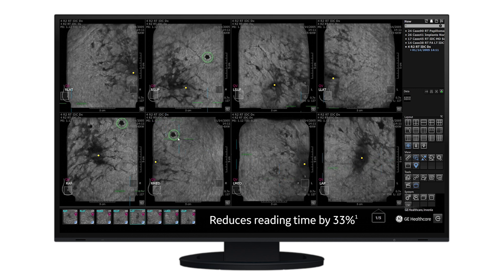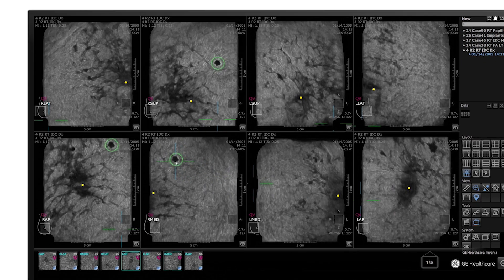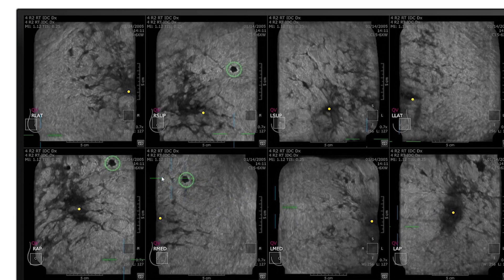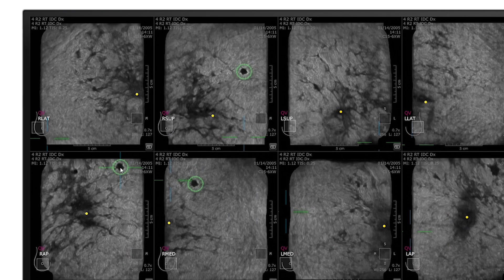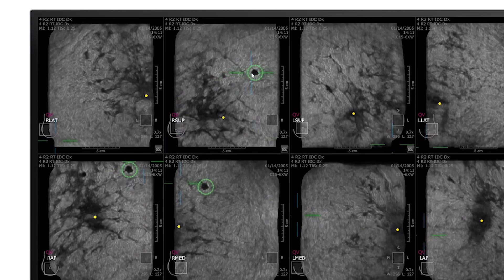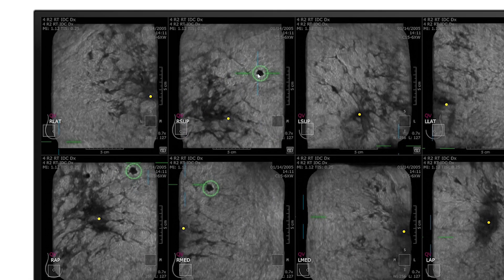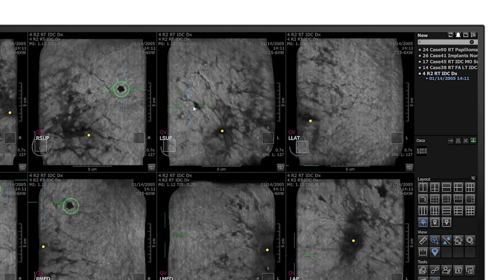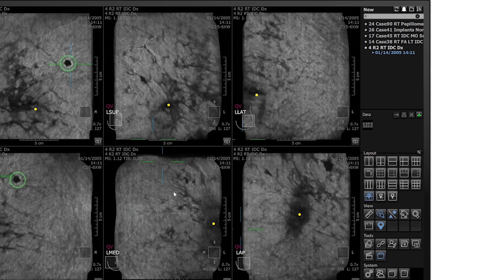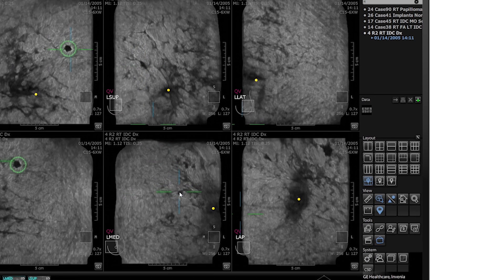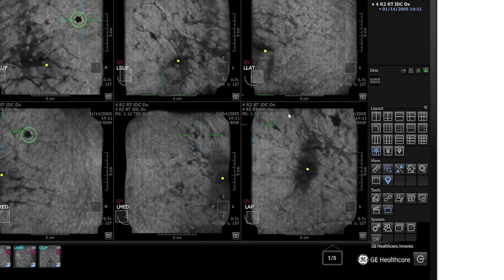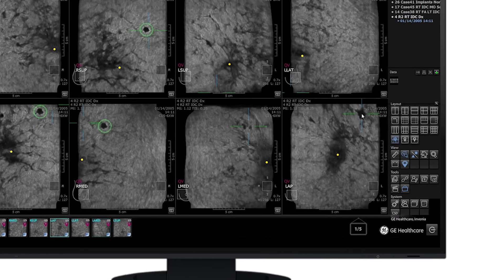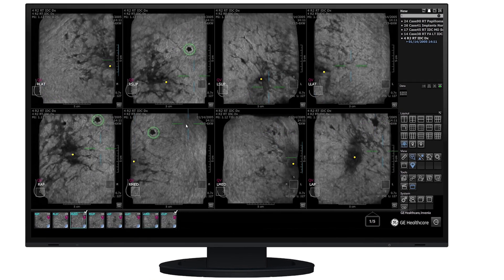QView CAD highlights areas in two ways. First, it superimposes and displays green CAD markers that highlight areas suspicious of malignancy. Second, it enhances dark areas that have less probability of malignancy.